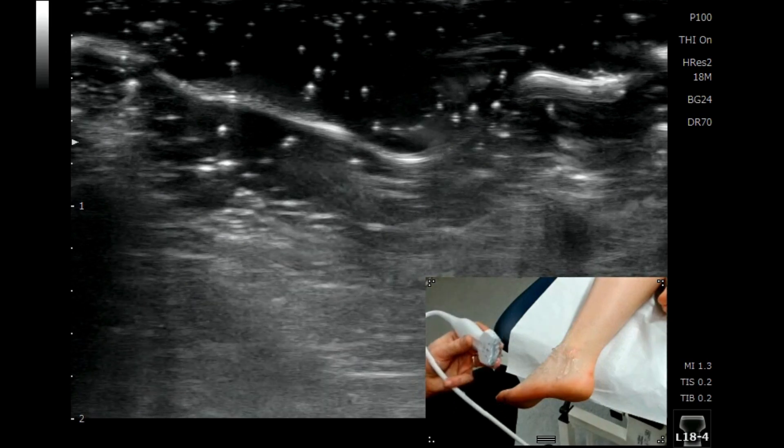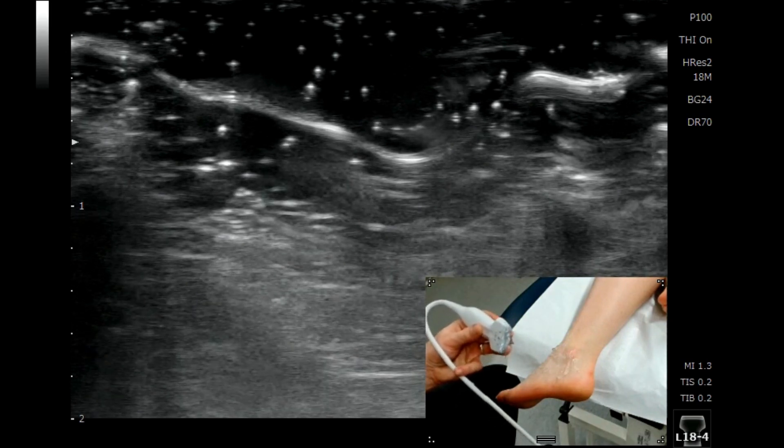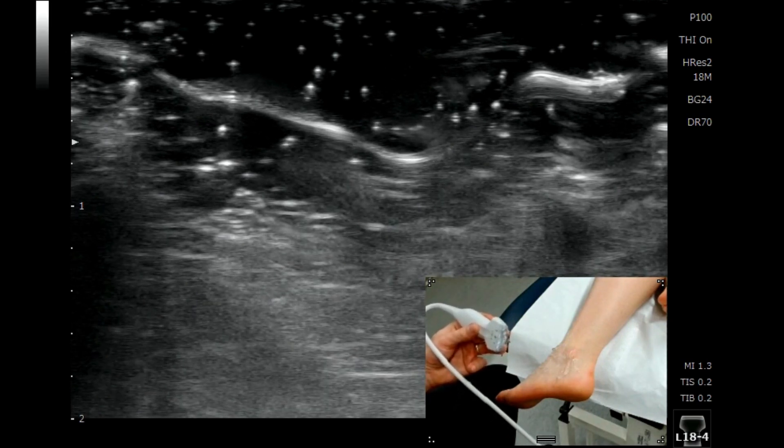In this tutorial we'll be scanning the anterior talofibular ligament, or the ATFL, and I'm going to show you a really nice easy way of finding this structure.